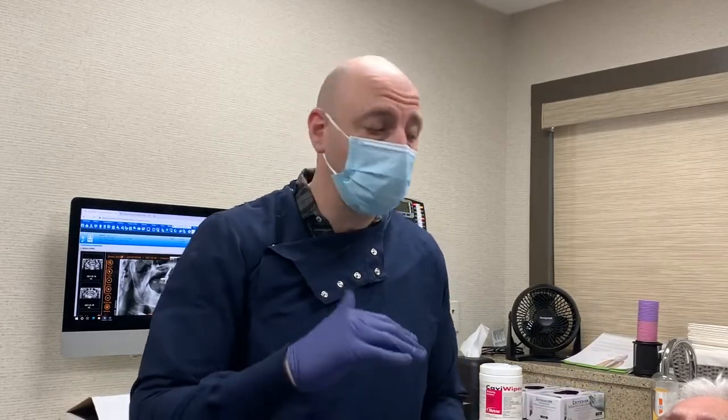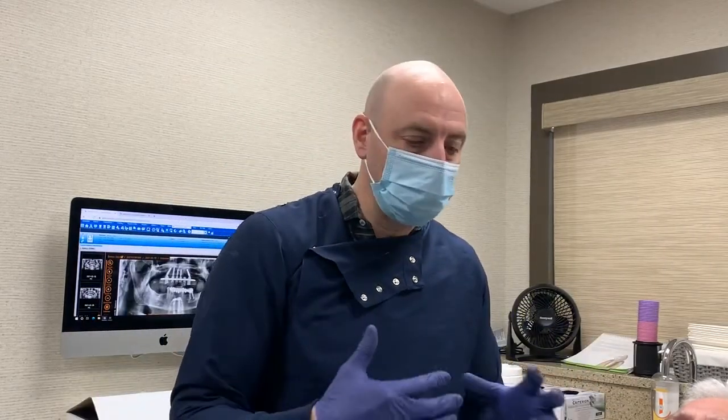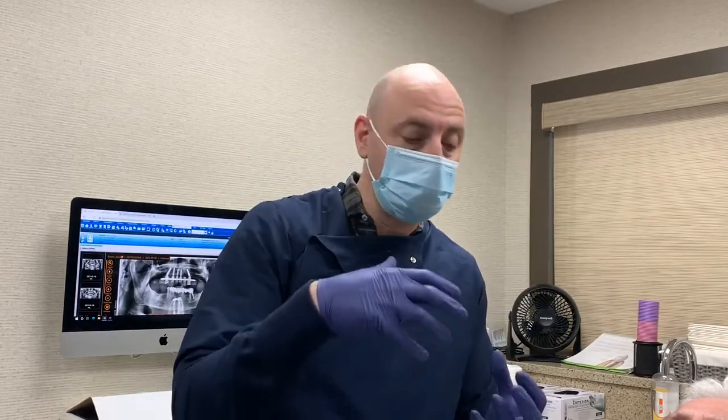Some practitioners don't like to do that. You could always take photos and take notes and relay that information to the lab so they can move the teeth in an appropriate position. But it's always wise to capture a new occlusal record or a new bite along with that appointment, so they can possibly remount it and reorient a couple of things to get a better outcome.